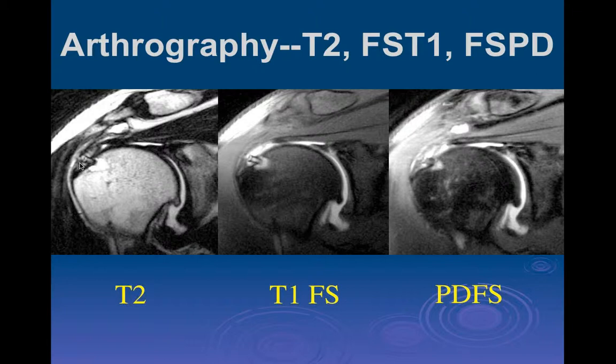So what you look for primarily is to see whether things are mechanically intact, which is what we see in this particular case. It doesn't mean the patient's not symptomatic. Obviously, the patient's probably symptomatic because they did an MR study. Whether or not you need to reoperate is based upon the clinical findings, like John was talking about, as well as the information we can give them concerning the anatomy that's there. So it's a combination of factors.